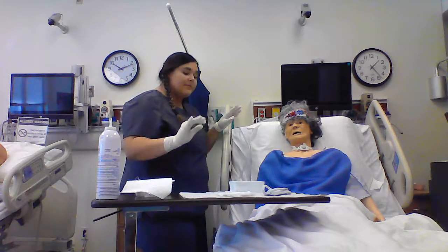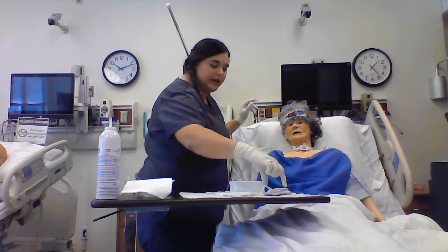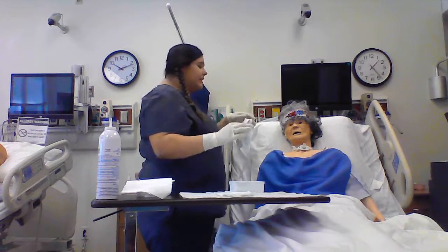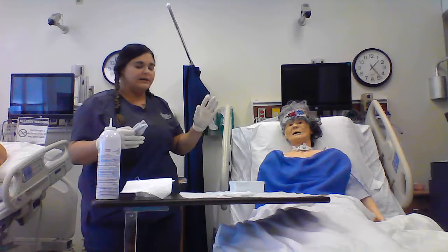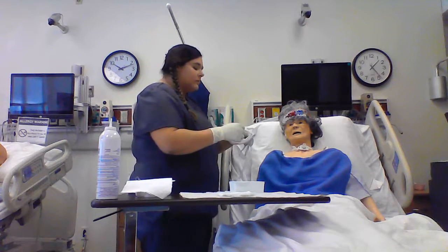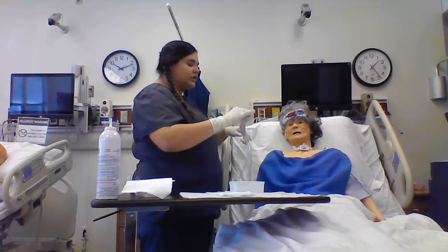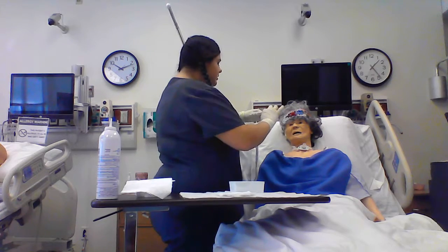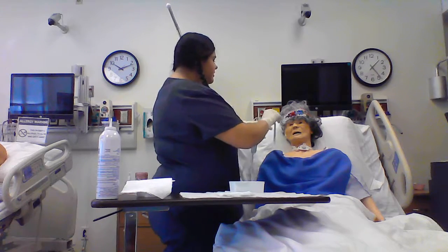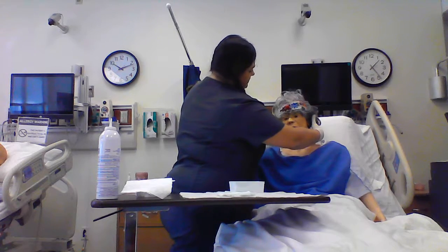Okay, and at this time, I'm going to go ahead and replace my ties around my patient's tracheostomy. If I had an assistant, I would have them hold the flanges and help me with the other side of the ties, but I don't. So Miss Opal is alert and conscientious enough that she can help me. So she's going to sit up whenever I ask her to. Okay, Miss Opal, go ahead and lean forward. Which she is.